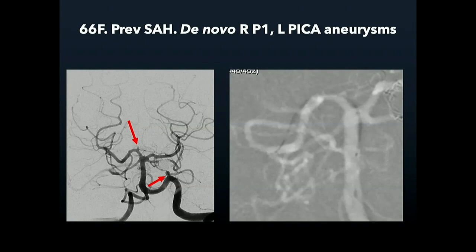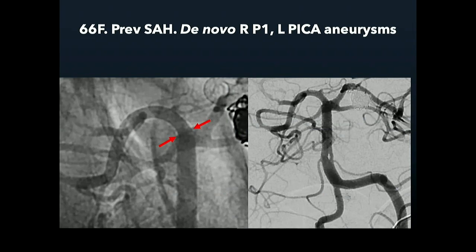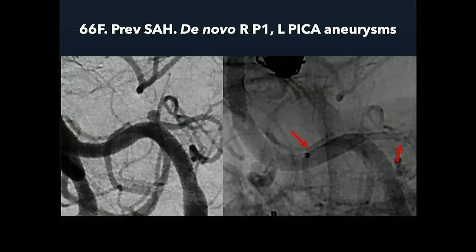And you can see the positioning of the Silk Vista. The back end of the stent is about here, about to be pushed out of the catheter, just there. And when we deploy it, you can see how flush it just shortens right up to that P1 origin and sits nicely across there.